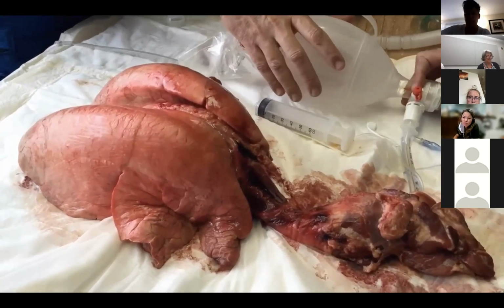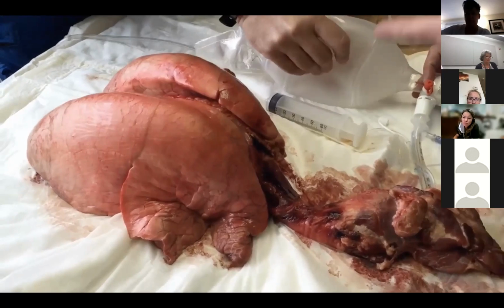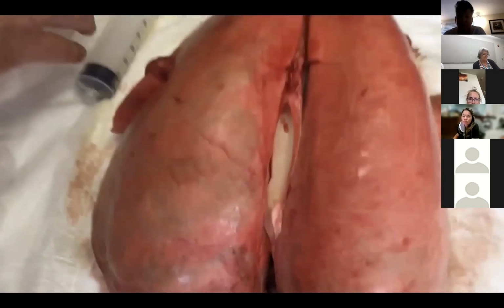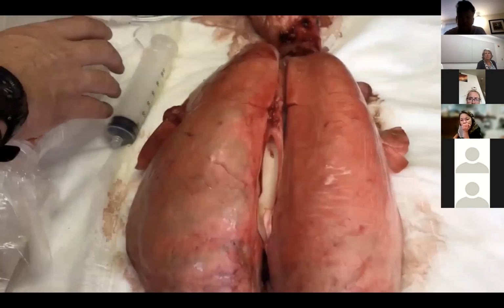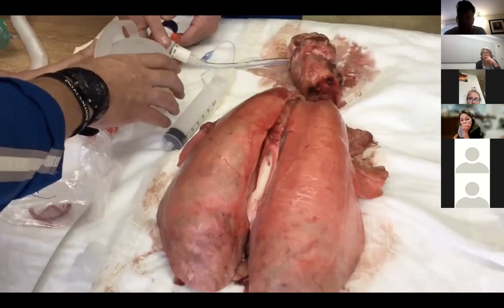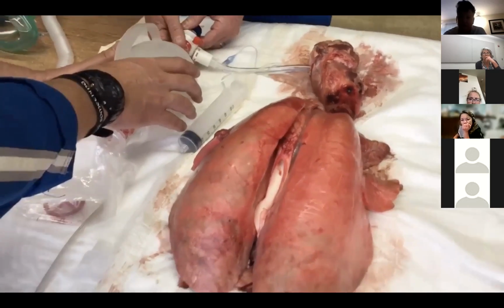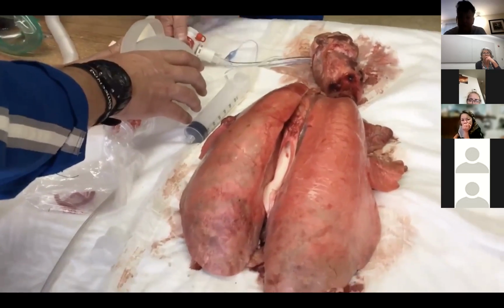You can see the difference when flight crews bring people, when we put people on our ventilator on PEEP, and then if you go to ventilate the patient with the BVM, you don't have a PEEP valve on, watch what happens to your lungs. So let's say the crew doesn't know what they're doing, or the ventilator's alarming, or worse, you get them in the hospital, RTs, they're bagging them. Watch what happens to my lungs when I take away that PEEP and you just go straight BVMing.